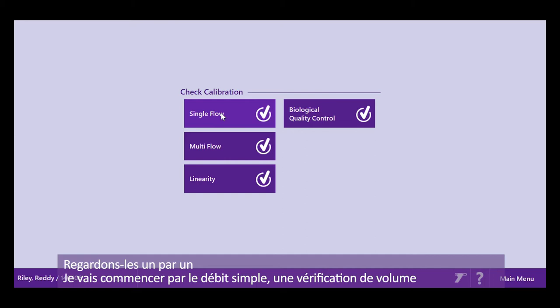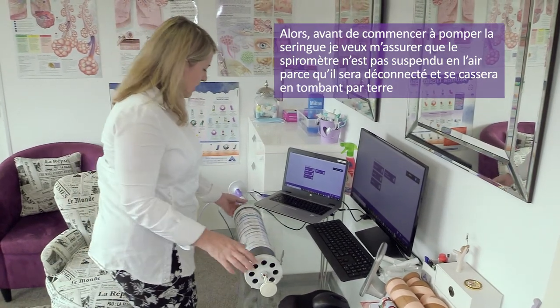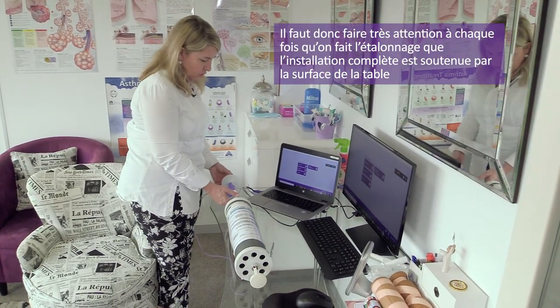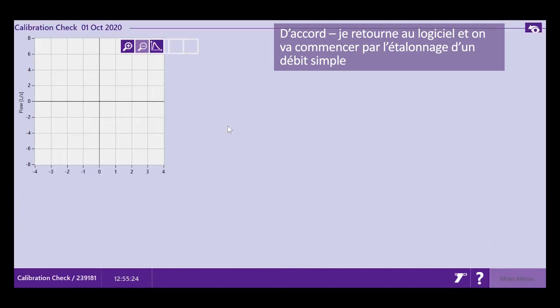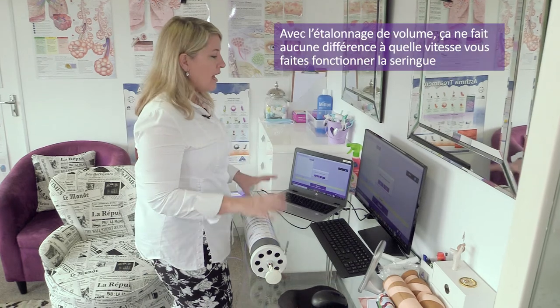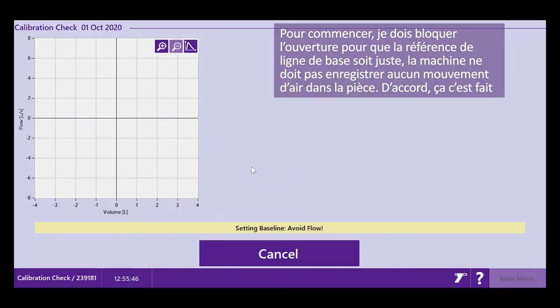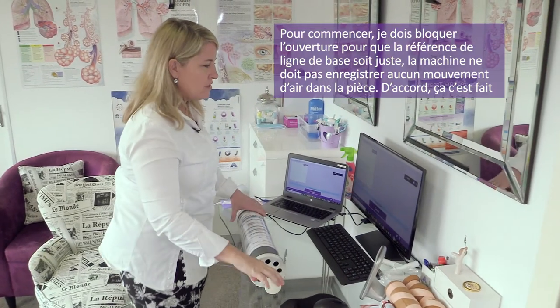I'm going to start by doing a single flow calibration — a volume check. Before I start pumping the syringe, I just make sure the spirometer is not near the edge of the table, because it will fall off and break. Be very careful every time you calibrate that your whole circuit is safe on the table. With a volume calibration, it doesn't matter how fast or slow you move the syringe.